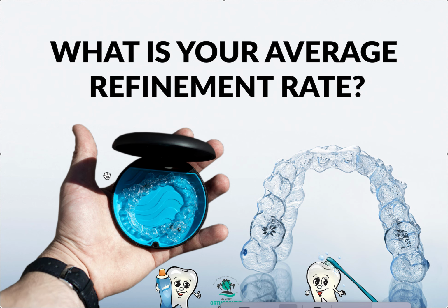There are free ones. If you're using Invisalign, you can use Invisalign Virtual. It's free. It's a little bumpy. It's a little clunky. You're going to have an app on your phone, the doctor's app. The patient's going to have a patient's app on their phone. My suggestion is that you help them download it and learn how to use it because it's not necessarily self-explanatory. You need to give them a set of retractors. You need to simulate it in the office at the delivery appointment, and make sure they know how to use it.